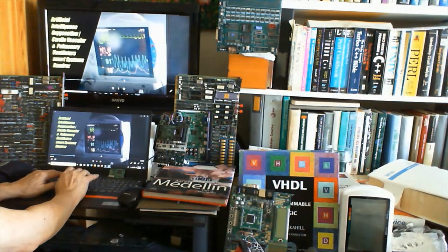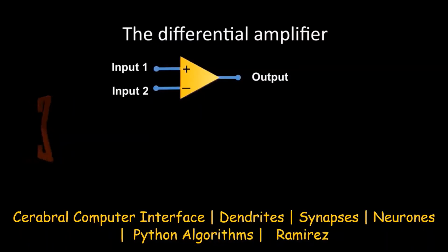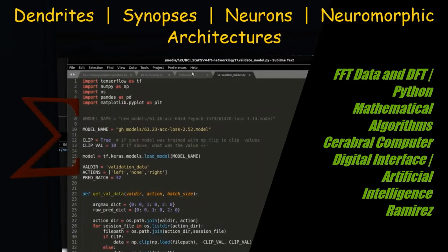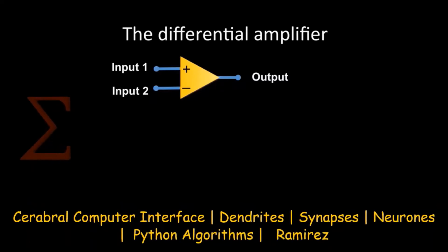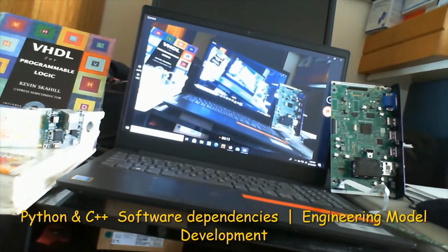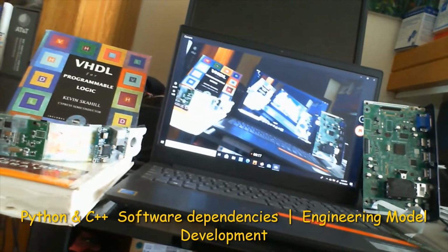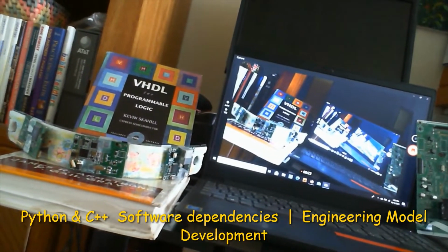For example, the power of the EEG signal in a specific frequency band for MI, 16 to 24 Hertz, for electrodes localized over the motor cortex areas of the brain, that is, around locations C3 and C4 for right and left movements, respectively.